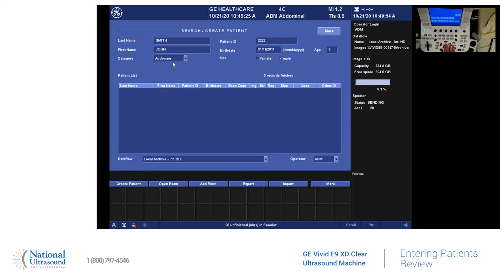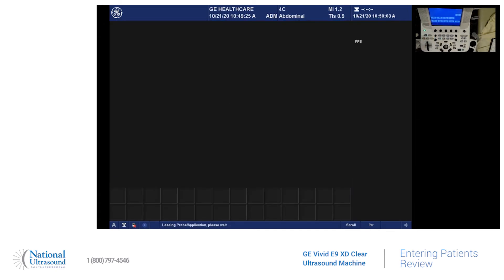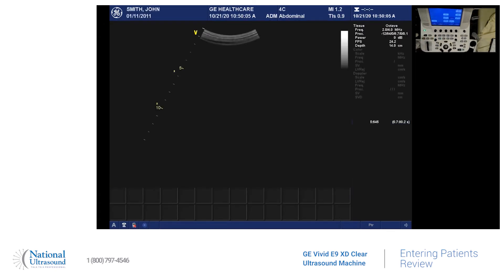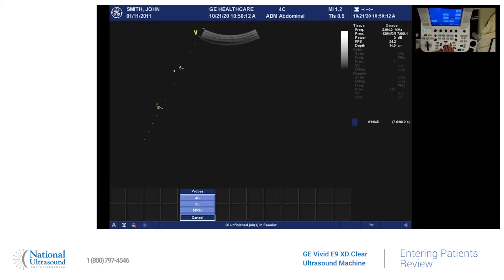So if we stay with abdomen, and then you can hit create patient. You can either do it using your trackball on the main screen, or there's also the touch screen options — you can just go here and hit create patient. And it's going to bring you back. Then you're ready to scan; you can press the probe button if you need to change your probe.